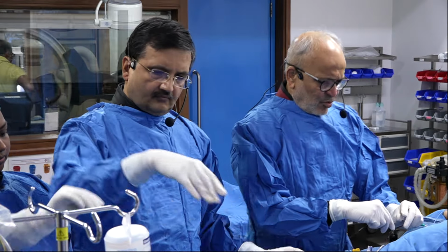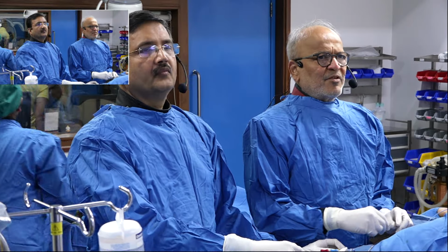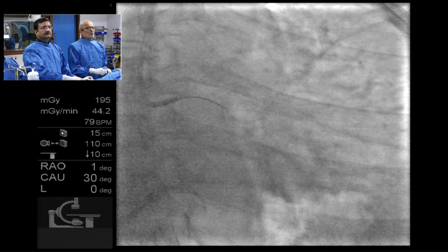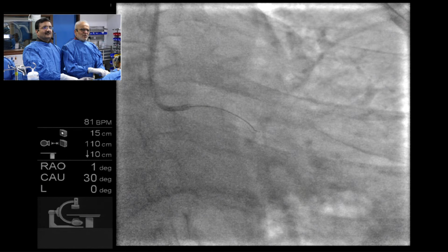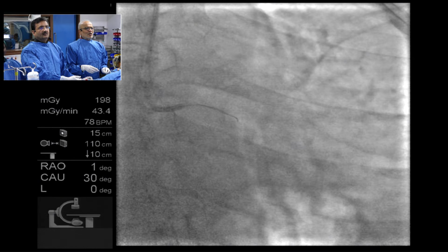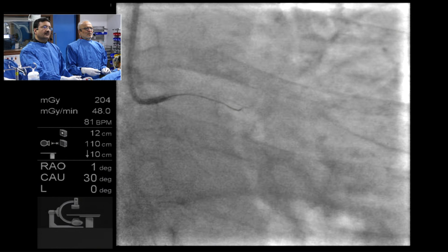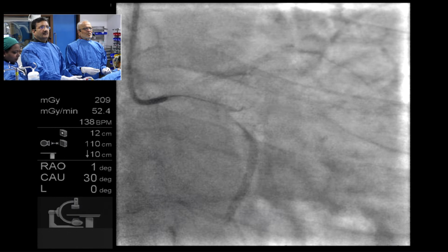Patient had posterior wall MI and transient hypotension and was treated in the periphery in Maharashtra, and then it was shifted. It is a recent MI, couple of days old. And what will be your strategy for the OM ostia? I think we have a clean OM ostium. There is no problem. Hopefully, it's okay. So imaging will help us to know how the lesion is extended. Very true.